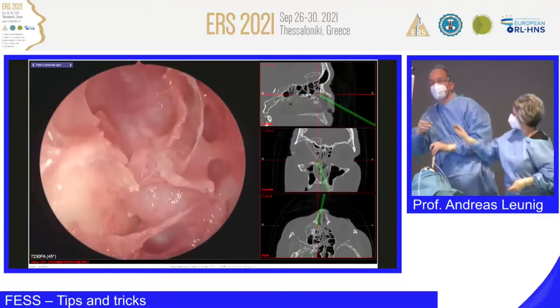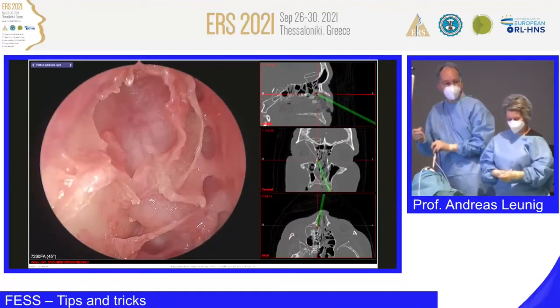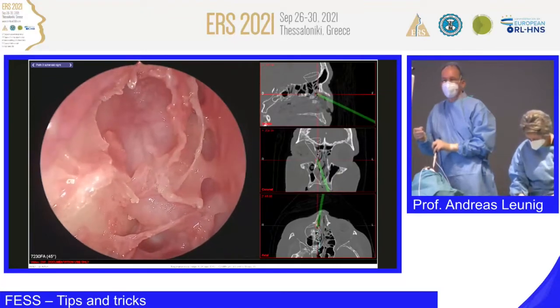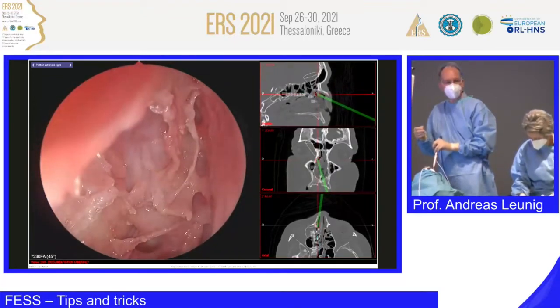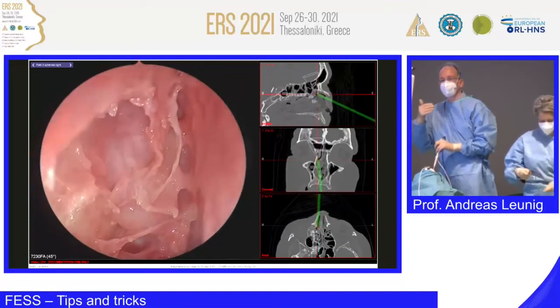Okay, so have a look here. Is this frontal sinus? What do you think? It's not the frontal. Okay, it's skull base, isn't it? Yeah, it's a kind of a cell which is protruding high up.